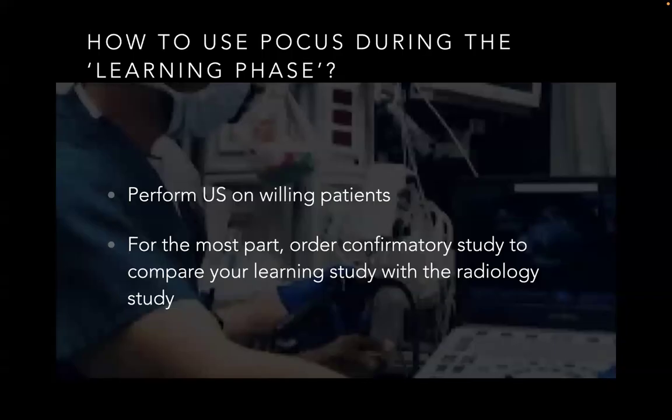Of course, as you do scans, you're going to be uploading into the Butterfly cloud, which I'll be talking about more later. This will be the way in which you can keep track of your point of care ultrasound scans, like a procedural log in residency. And it will be through this log that you'll be working towards credentialing.